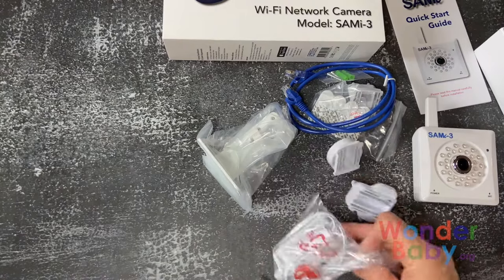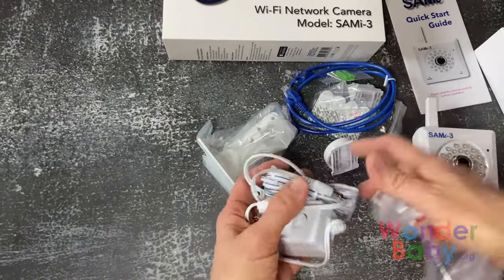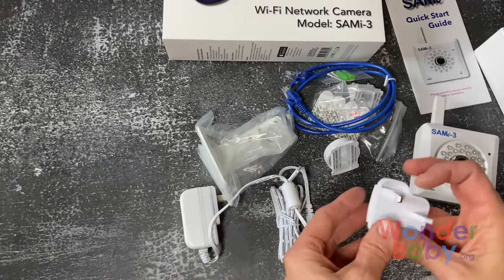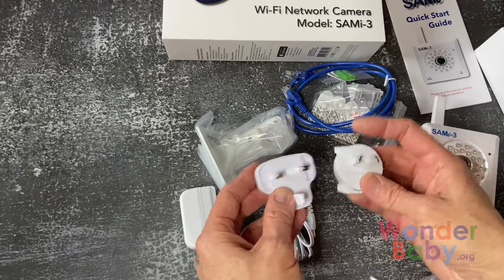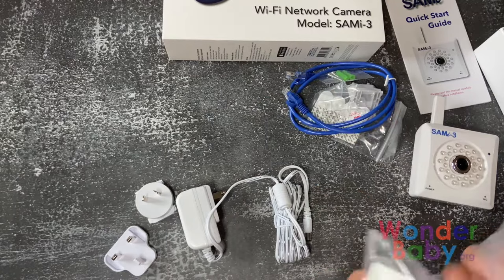The first thing we have here is the AC power adapter, which also comes with some plug adapters so no matter what country or region you're in, you should be able to find something that will fit into your outlet.